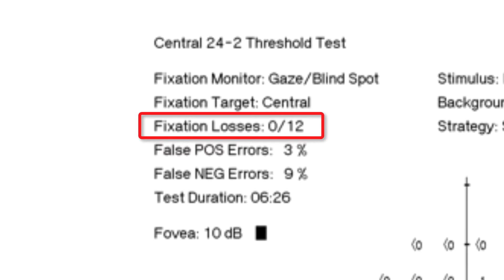Fixation losses should not exceed 20%. Now look at false positive errors. These responses measure how often the patient signaled awareness of the stimulus when it was not shown. In other words, the patient jumped the gun or was trigger happy. False positive errors should not exceed 30%.